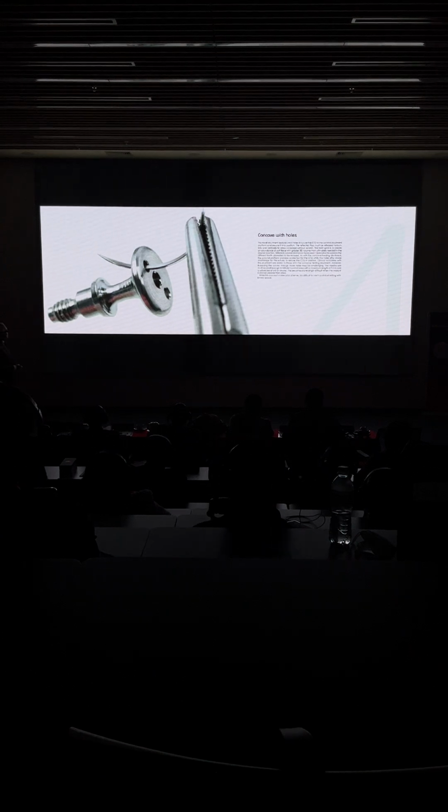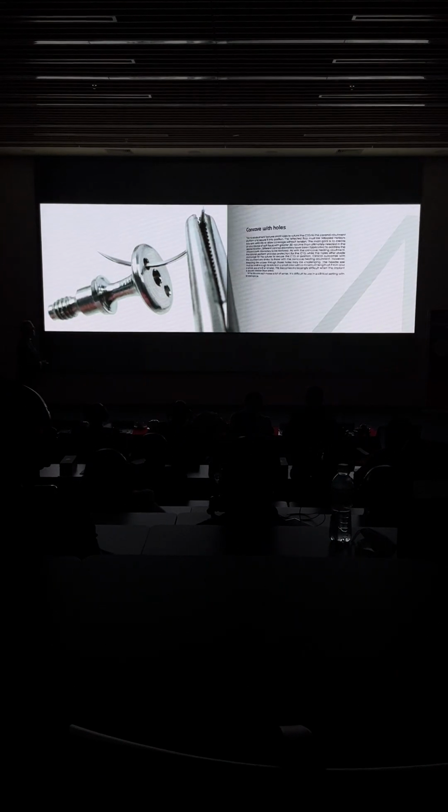I had another one that was just a notch, so you could go through the notch and pinch your suture in an easier way, but none of those really show the difference.